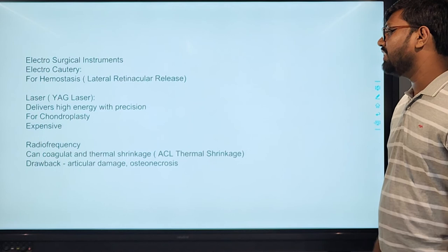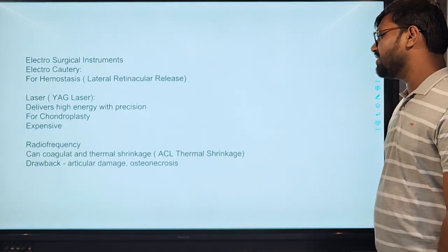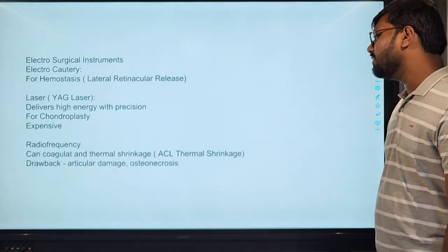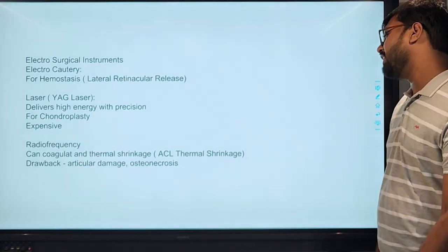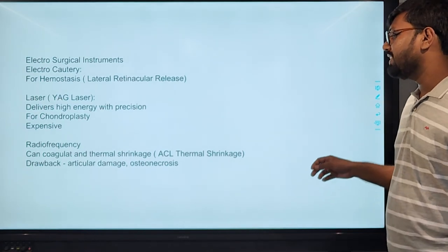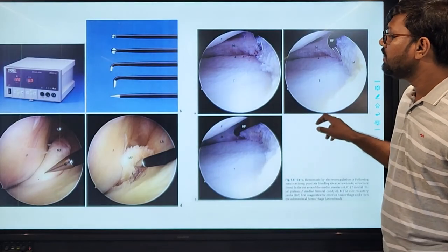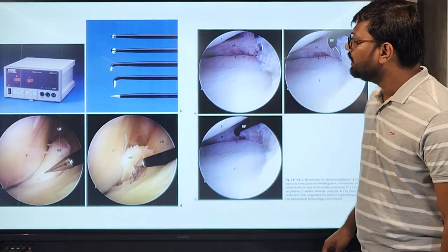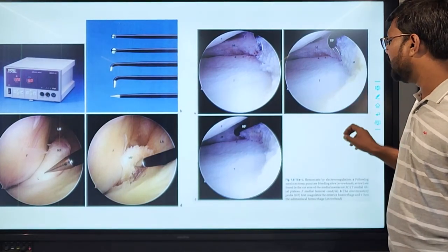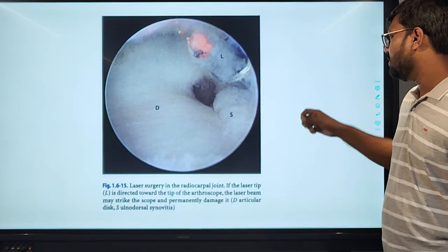We can also use the laser, and they deliver high energy at a precision point for use in chondroplasty and other surgeries, but they are very expensive. And radio frequency can coagulate, and is used for thermal shrinkage of the ACL and other procedures. Drawbacks, they can cause articular damage and osteonecrosis. These are the tips of the various electrocauteries and instruments. These are arthroscopic images of that. This is the laser used in laser surgeries.